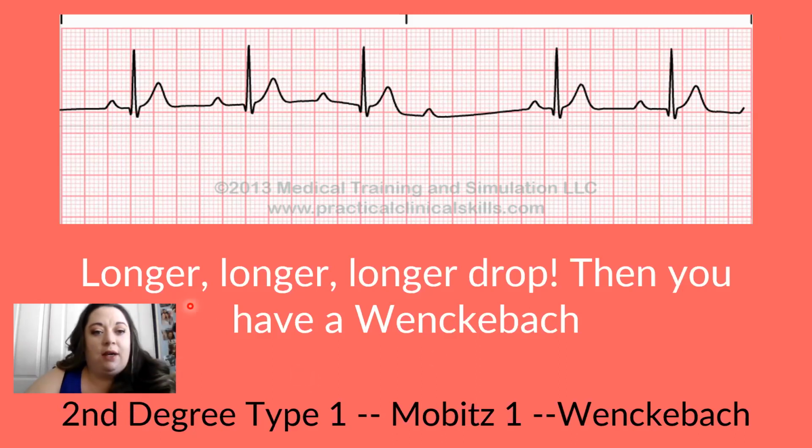The one thing I want you to take away also is the poem is longer drop. And here we see a longer PR, longer, and a dropped beat. It's not always 4, okay? It could get longer and drop on the 3rd beat, on the 7th beat. I do want you guys to know that it can vary.